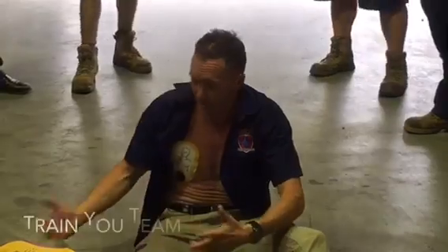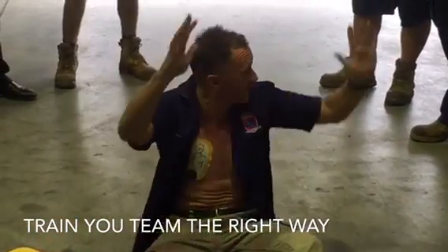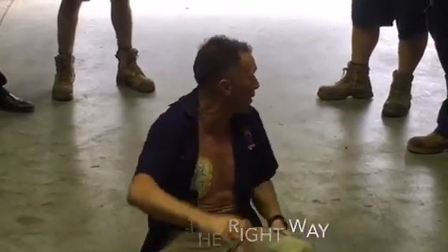Compressions only today because I've got an open airway. Get the defibrillator on. Good save, boys.